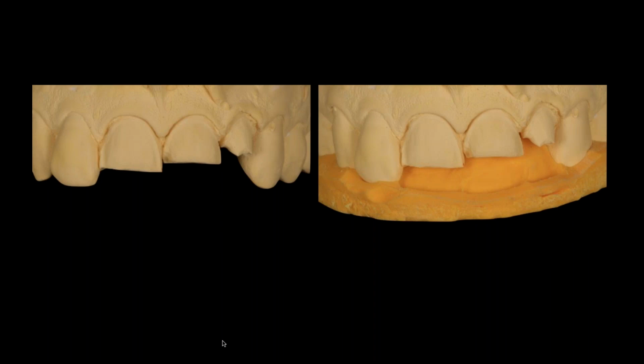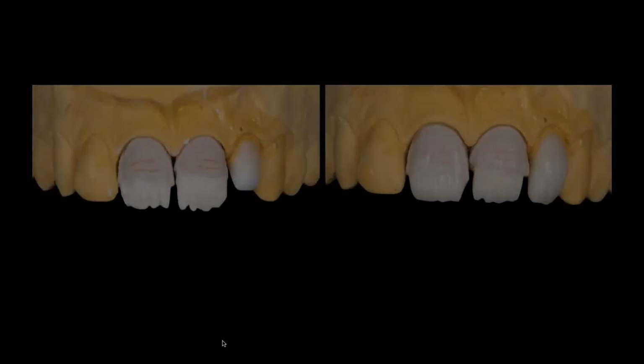If you chose a lithium disilicate or lithium silicate material, you realize that at the very thinnest area, it's going to be very, very translucent. But at the very thickest area, it may not be as opacified as you need, because you still have to set it up like a dentin structure, and that becomes a little challenging. So I wound up treating it feldspathically.